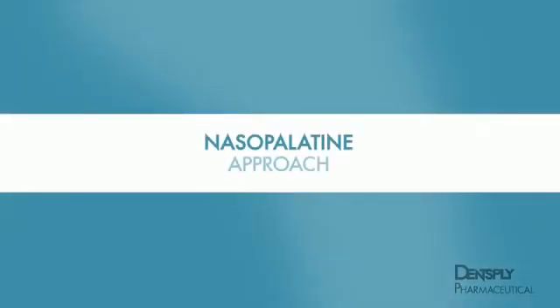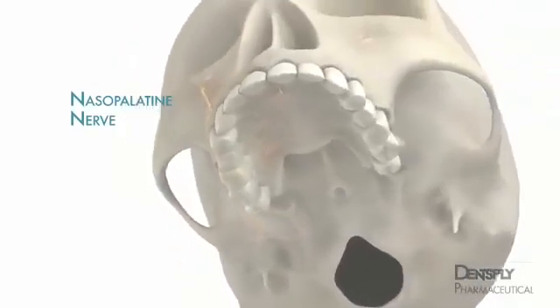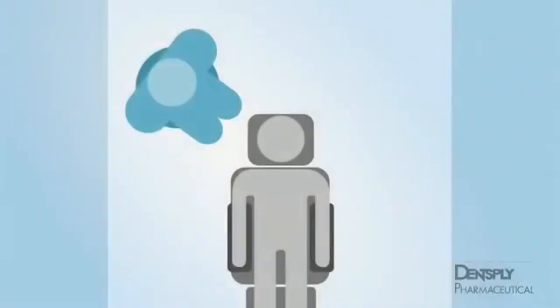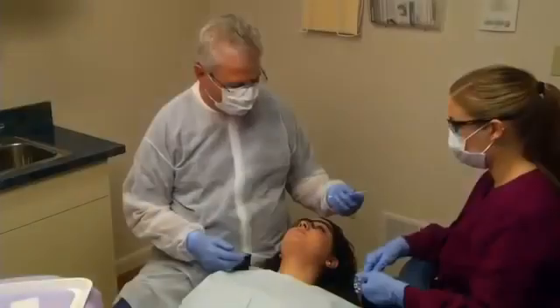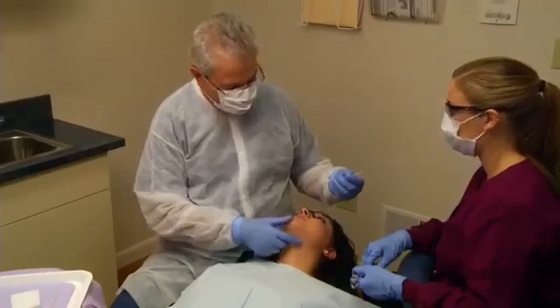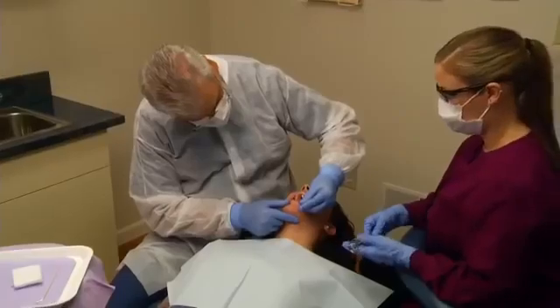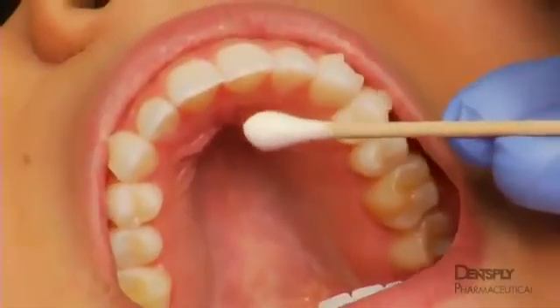Nasopalatine nerve blocks are indicated for pain management of palatal soft and osseous tissue in the anterior third of the palate, approximately from canine to canine. Assume an 11 o'clock position for the right-handed operator and a 1 o'clock position for the left-handed operator. The deposit location or target area for the nasopalatine nerve block is the incisive foramen beneath the incisive papilla. The injection site is the palatal tissue lateral to the incisive papilla, which is located at the midline.